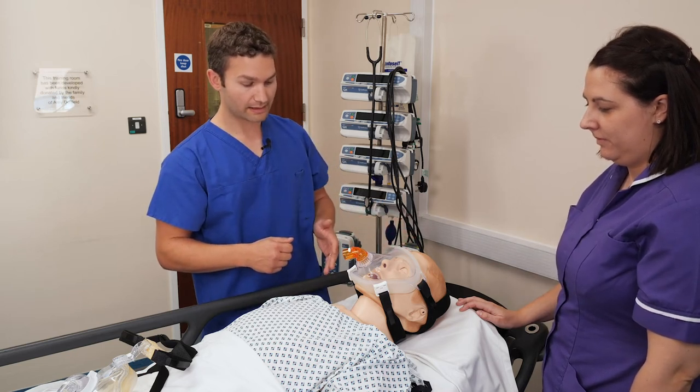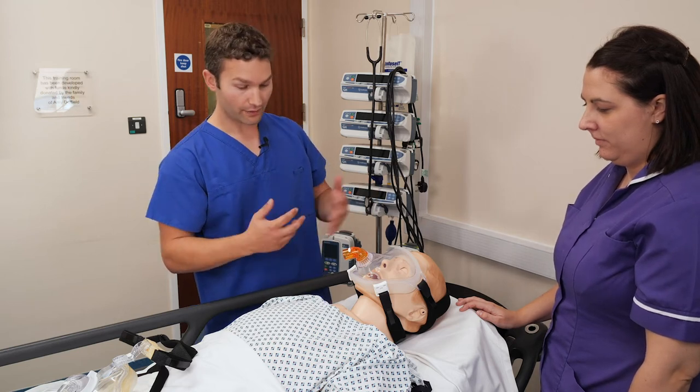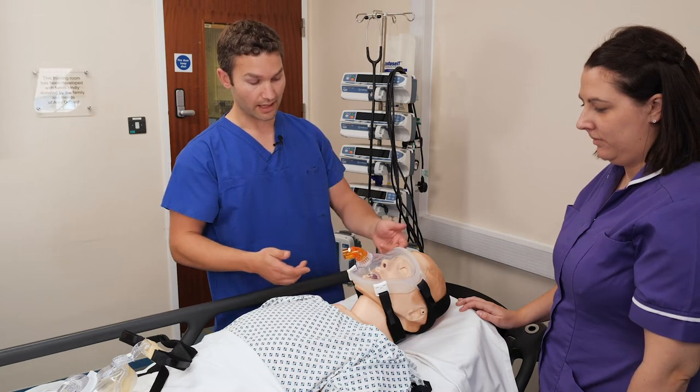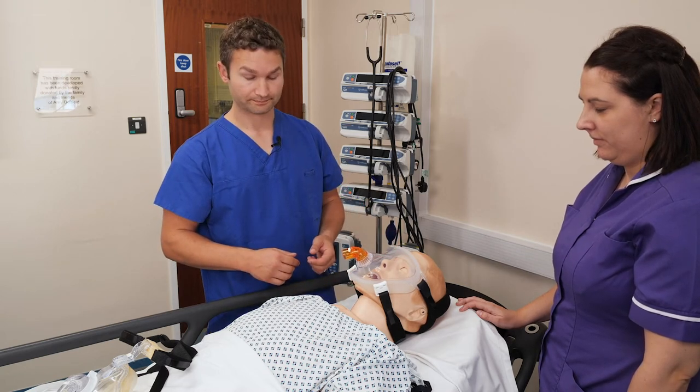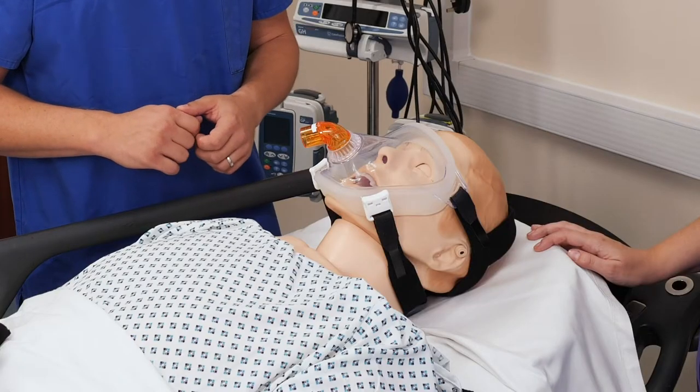When the mask has been applied, make sure you take it off at regular intervals to check the skin. Areas of issues for a full face mask may be the bottom of the chin and just above the eyebrows. And that's how you fit a full face non-invasive ventilation mask.